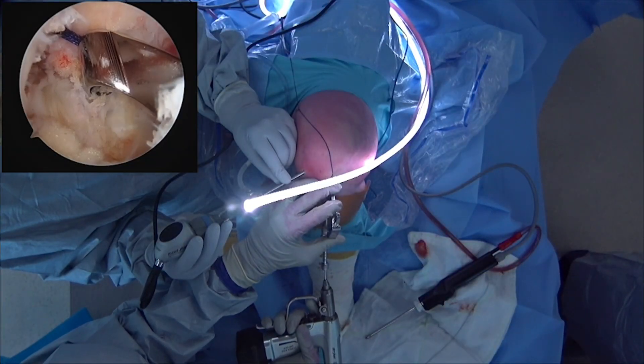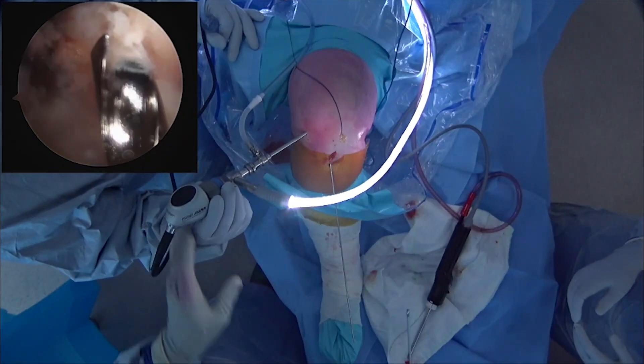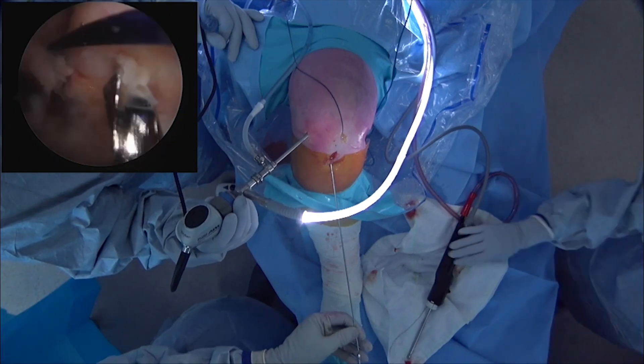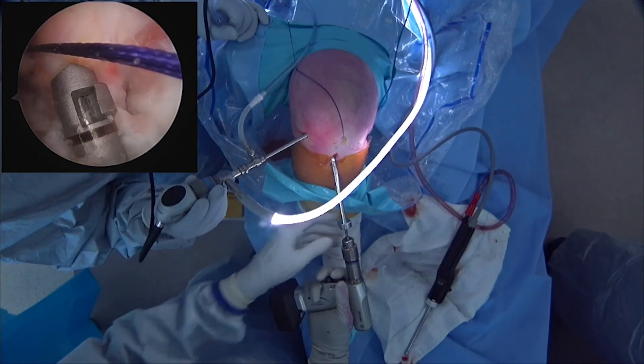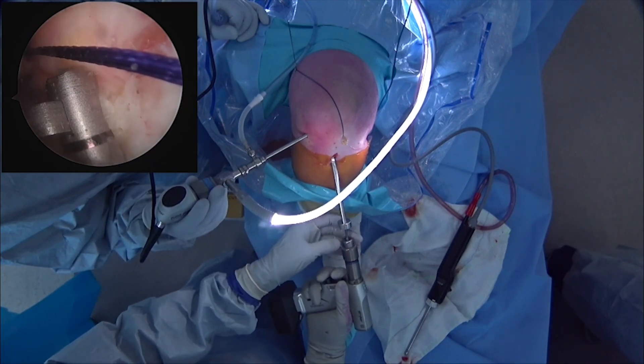The components of the operation within the knee joint are to create tunnels or sockets at the normal location of the anterior cruciate ligament. This is the attachment or footprint on the femur and at the top of the tibia. I perform an anatomical reconstruction, meaning the graft is secured in the usual and exact location of the attachments of the ACL, and we find that this best reproduces the stability of the knee.